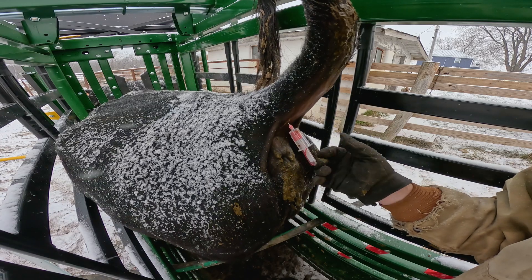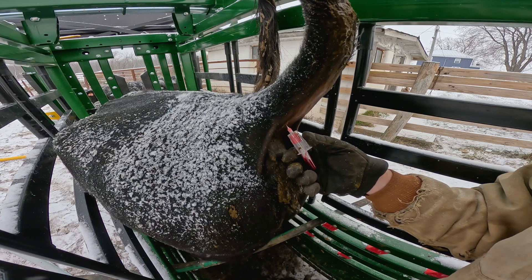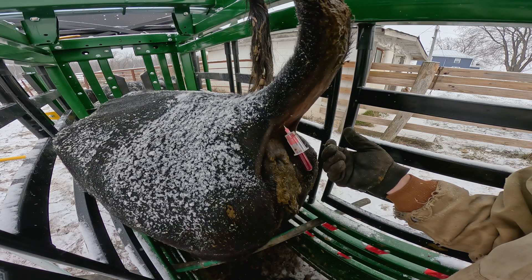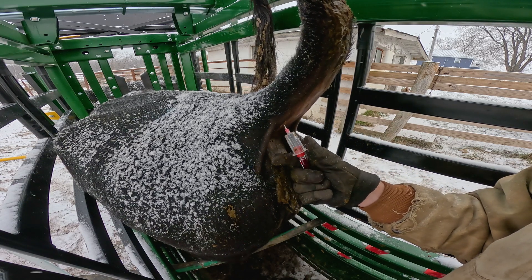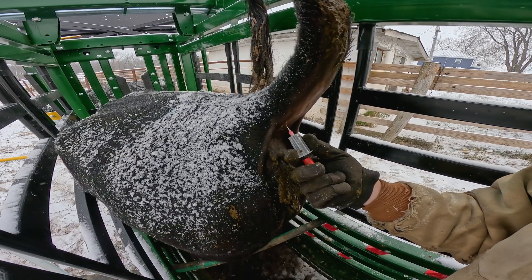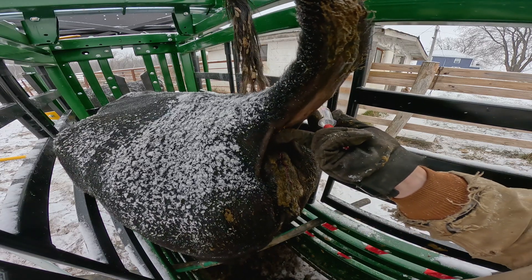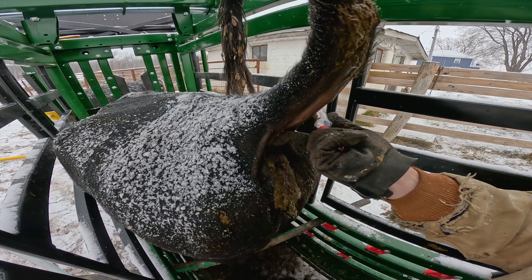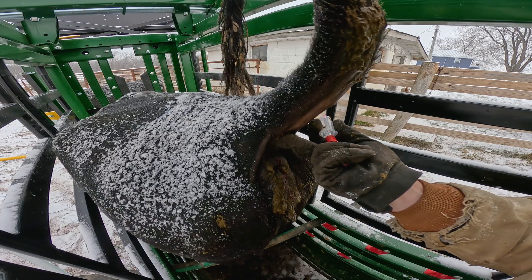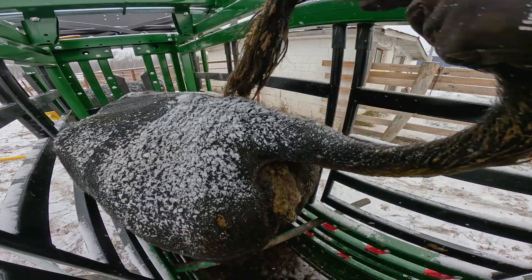You can see a little blood came in. I didn't get the placement quite right, so I can go ahead and pull out a little bit. Did you see how much more it started to fill? I aim for about two-thirds. You go ahead and pull that off. Once you're done, you want to hold your finger on there for a couple seconds to stop the bleeding. Not all of them will bleed — some of them will. Now she's done.